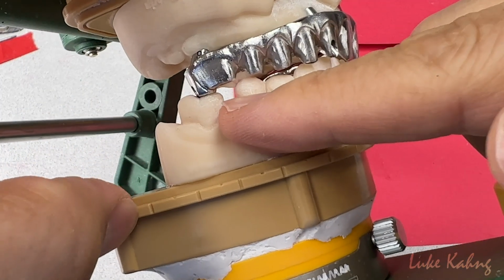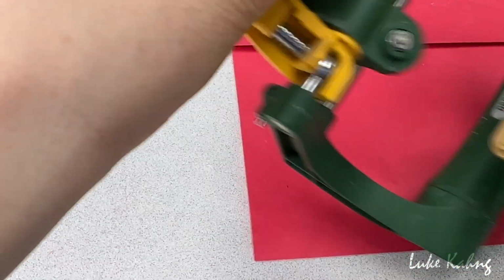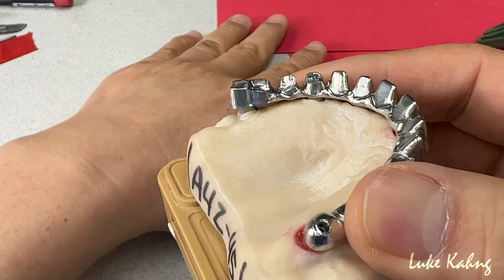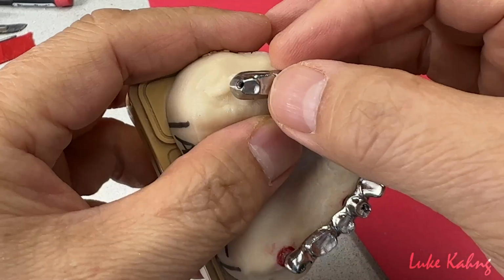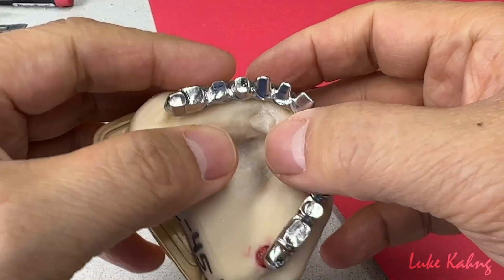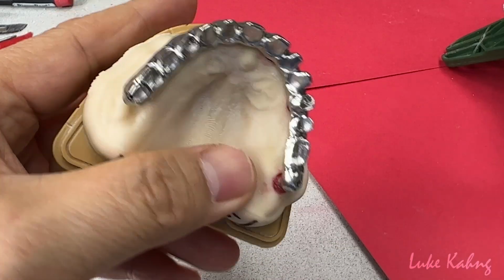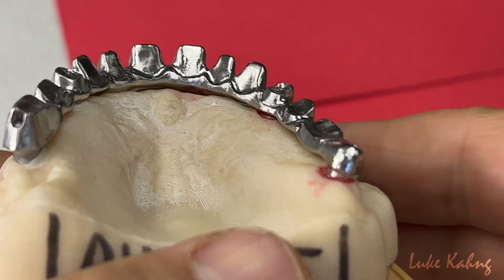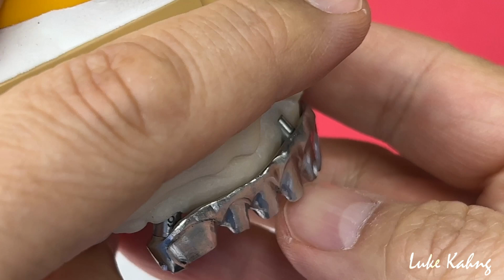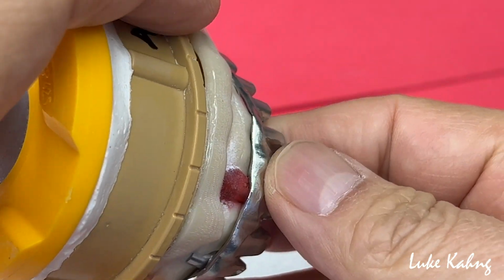We designed exactly about the metal island at the top of this. So now the frame is finished with the articulation, and then our specific design here is for the metal. Zirconia will now cover those areas, so we're going to finish this line angle here. But the other ones are open as much as possible, because the patient wants more hygiene. So we open it up, trying to make a 1 millimeter smooth area. And then I'm going to try to open here a little bit more. And then flossing from the lingual will be okay.